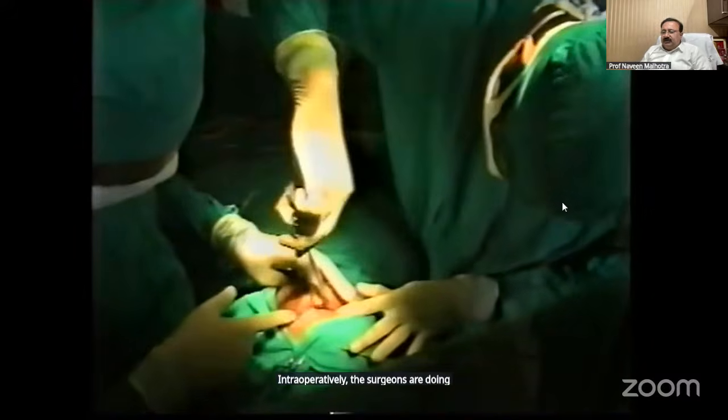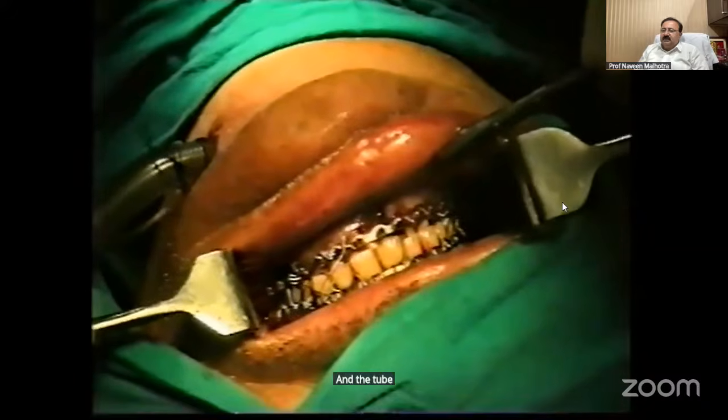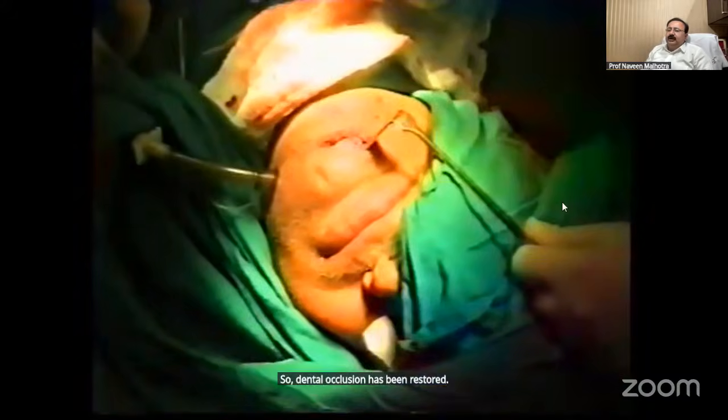Intraoperatively, the surgeons are doing maxillomandibular fixation and the tube is lying just away. So dental occlusion has been restored. So they are operating over the mandible and maxilla.